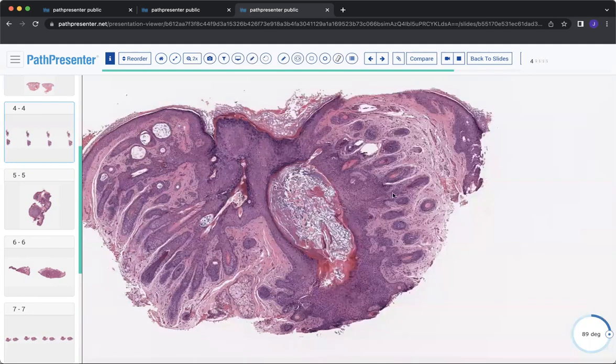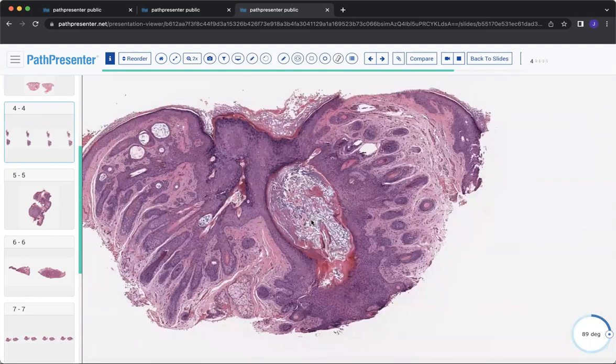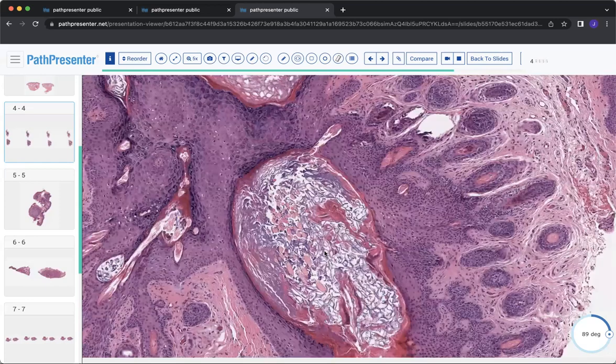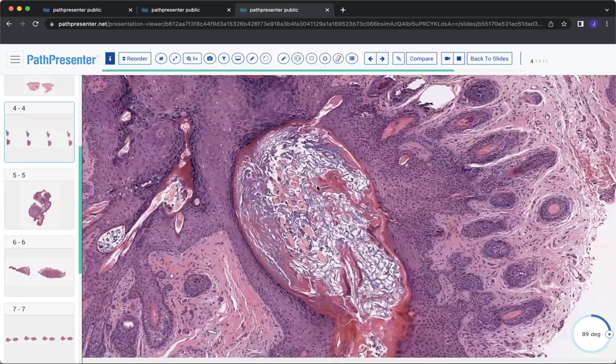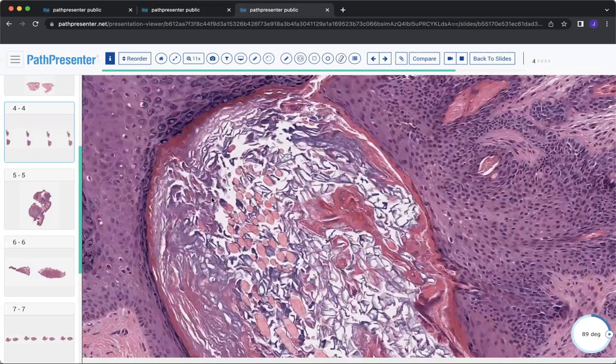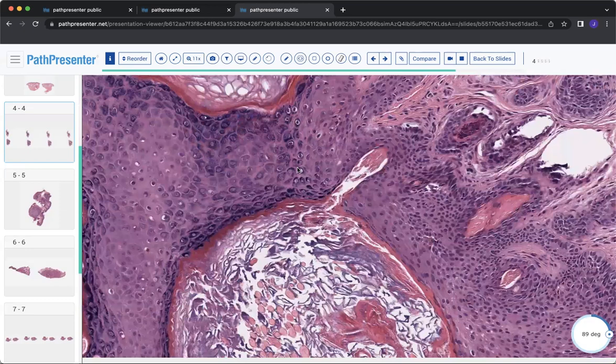And if you get it in the right plane of section, you'll be able to call this a trichofolliculoma. So the way I remember that is in a trichofolliculoma, you have a lot of tricho structures going into a large follicular ostia, so trichofolliculoma. It's the entity where you have several daughter hair shafts going into a large mother shaft, but it's essentially just merging together. And clinically, you're going to see a tuft of multiple hairs coming out of one central area. So that is a trichofolliculoma.